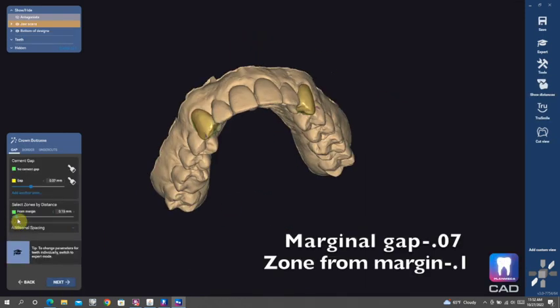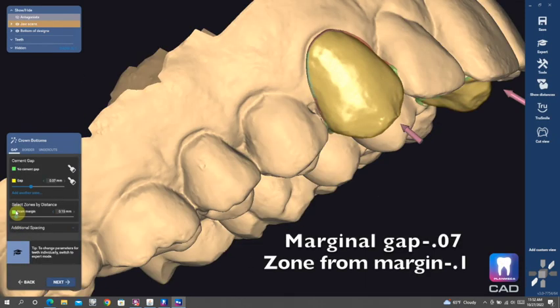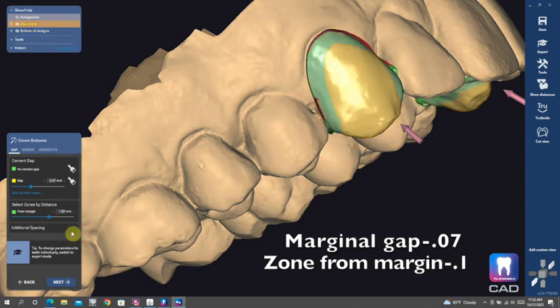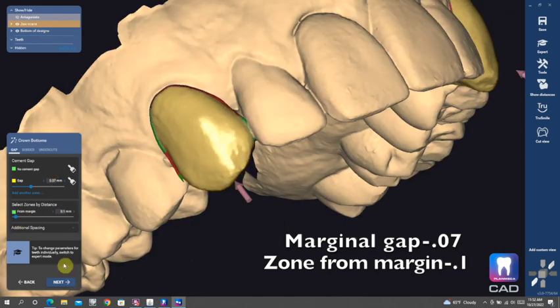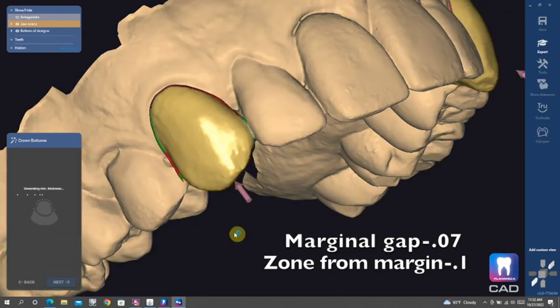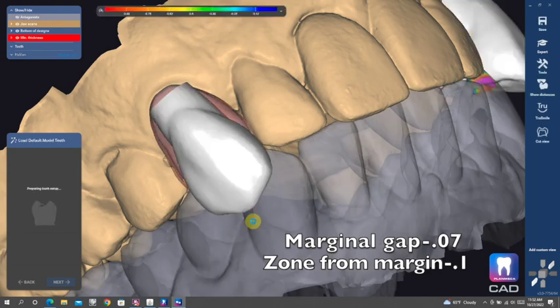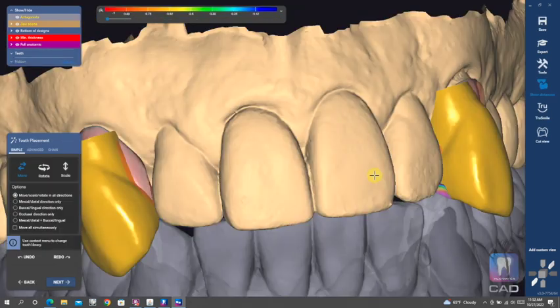Going through and doing our path of insertion, trying to minimize any undercuts. And then going through and tweaking that cement gap.